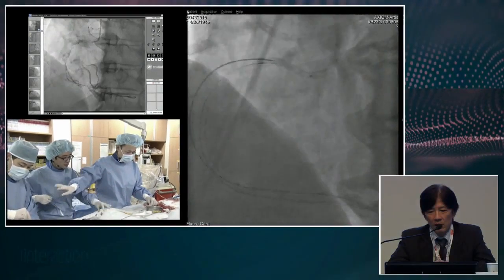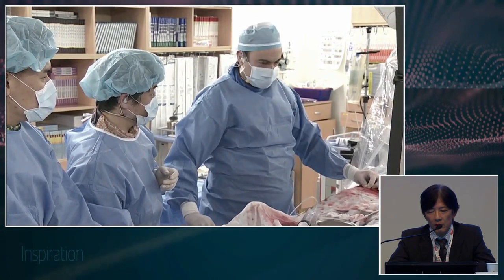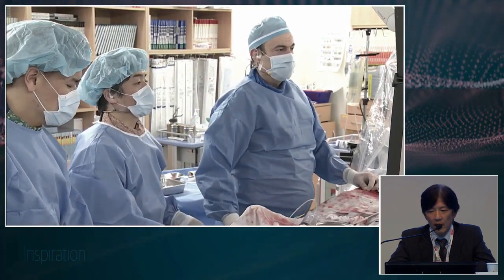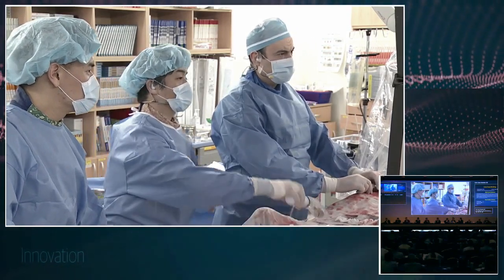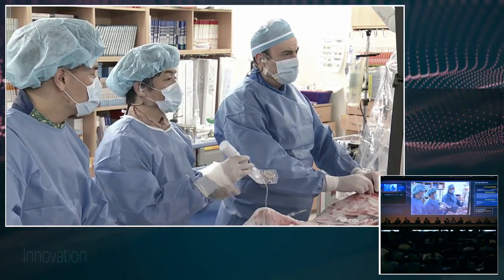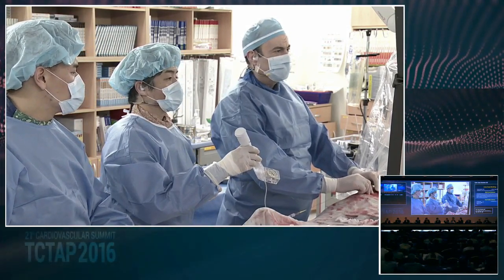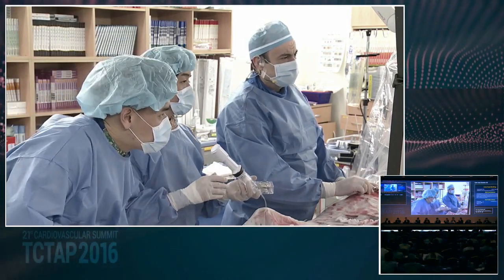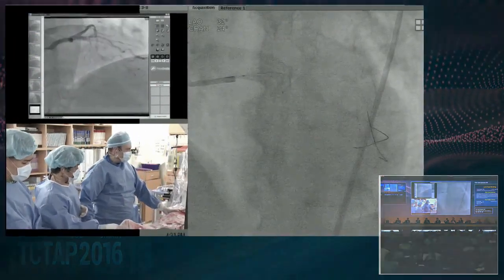Dr. Dimitri, you are on air. Yes, thank you. So we did put the stent in the mid LAD. We put a 3.0, and we're going to do a crossover in the left main. Little test, please. The ostium is okay, so we don't really need to nail it.